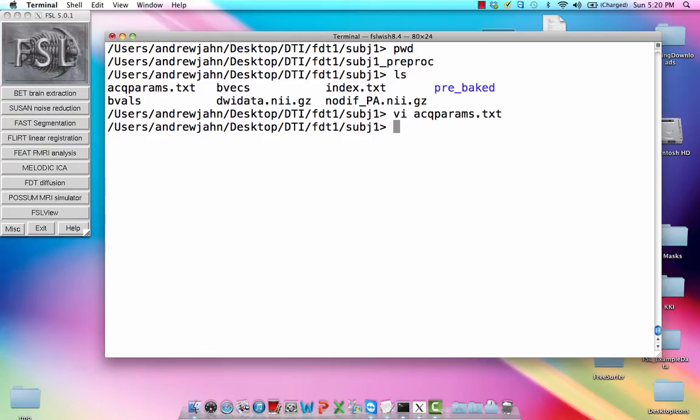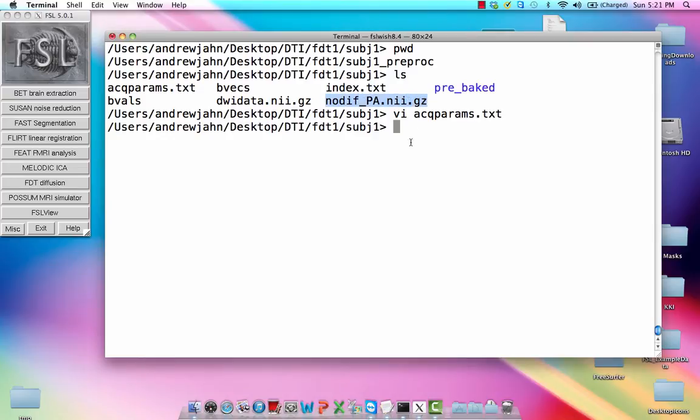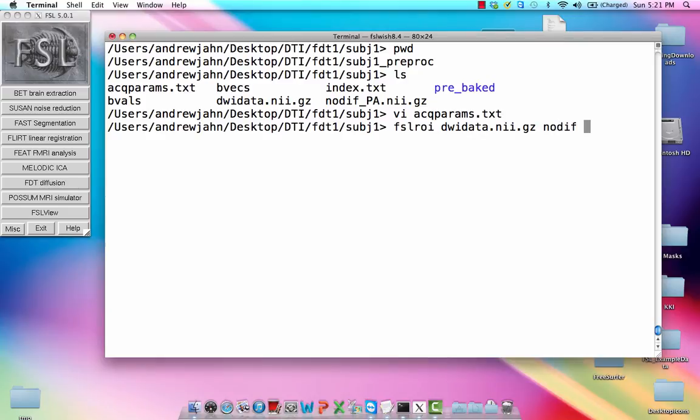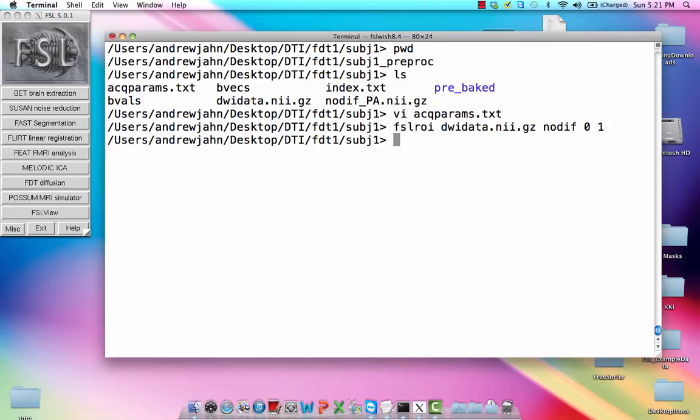So the first thing that we want to do, and also notice that we have a couple of things here. We have the diffusion-weighted data set. We also have this no-difference posterior to anterior acquired data set. So we want both the posterior to anterior acquired data set and the anterior to posterior acquired data set. So how do we get that other one? Well, we're going to use this thing called FSL-ROI to basically extract the first frame or the first image of our DWI data set. We're going to extract it from DWI data. This is also called no-dif, it's basically our reference volume, and we're extracting it from the very first image of that data set.